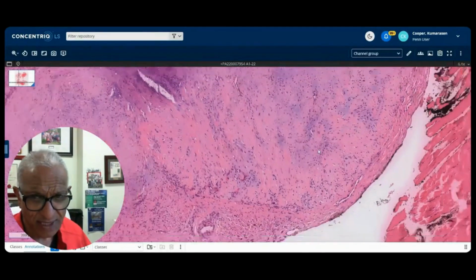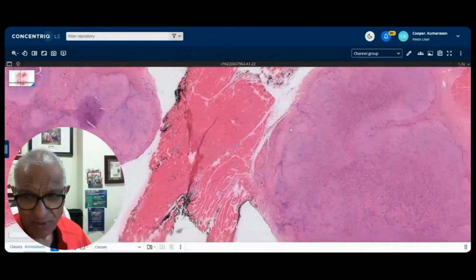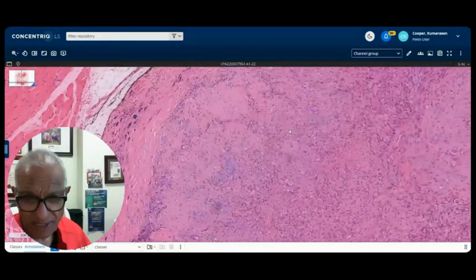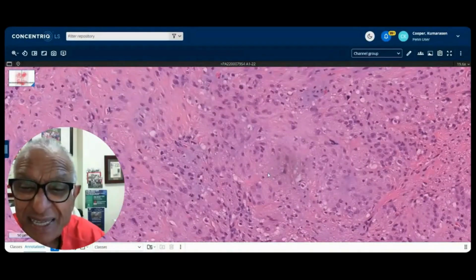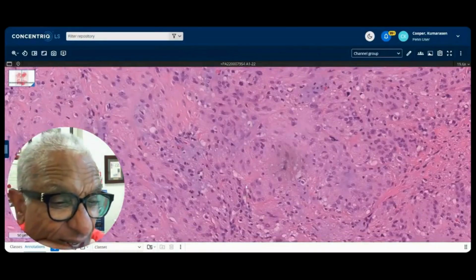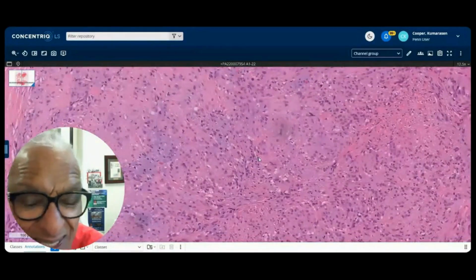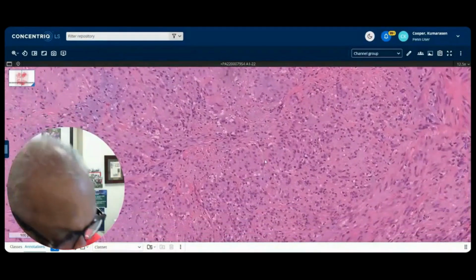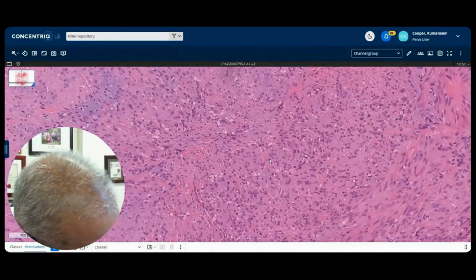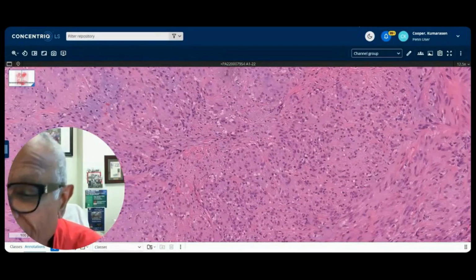nodular fasciitis. I haven't heard anything about it since then. And so, I'm assuming the patient is well. Remember, if you call something nodular fasciitis and it comes back, then you have to go back and look at it again. Although more recently they've been talking about some that have been aggressive because these are now regarded as neoplasms. So it's been an area that's been changing and shifting in recent times. Any questions on that? Anybody?